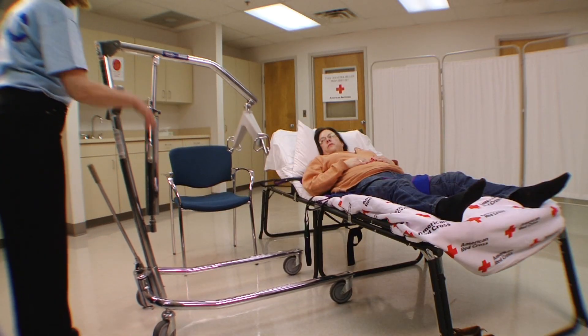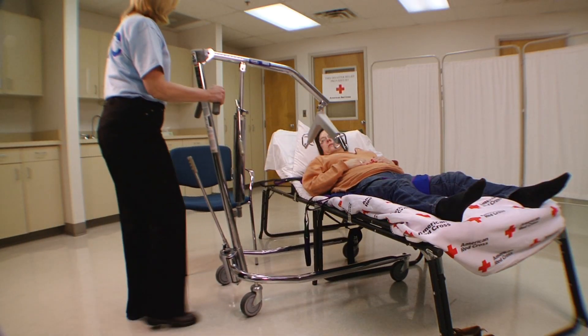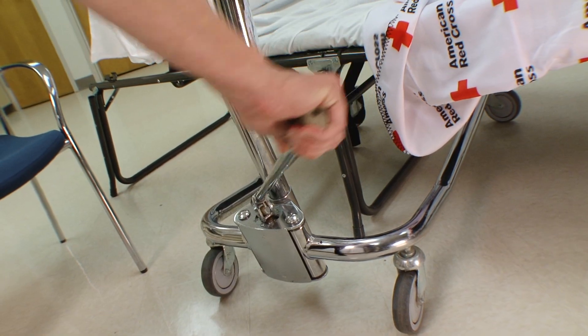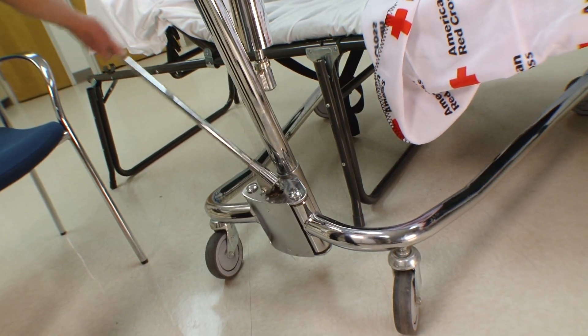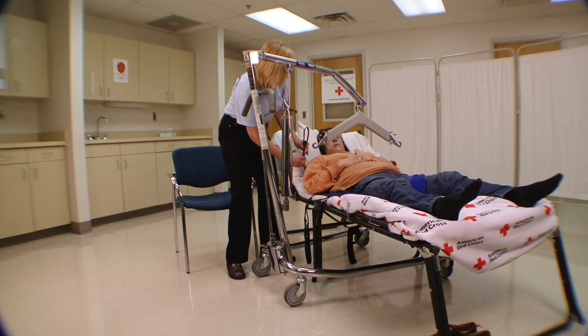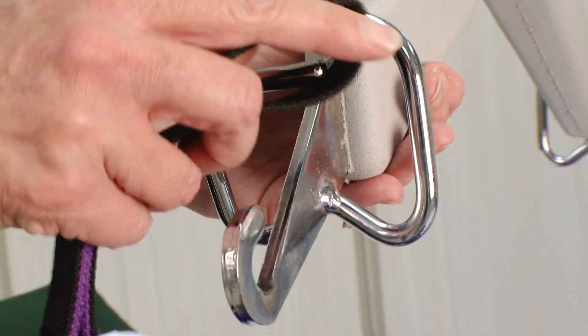Move the lifter into position with the cradle bar positioned directly over the individual's chest. Move the arm of the lift to spread the legs of the lift wider for more stability. Take the loops on either side of the top of the sling and hook them to the cradle.